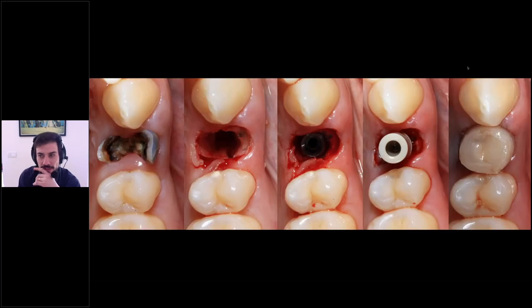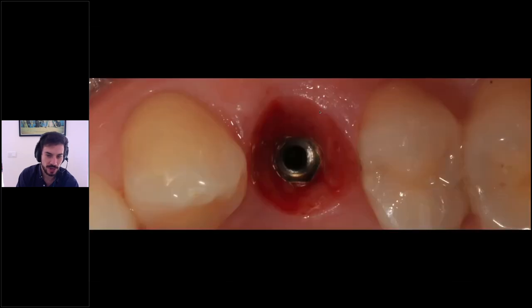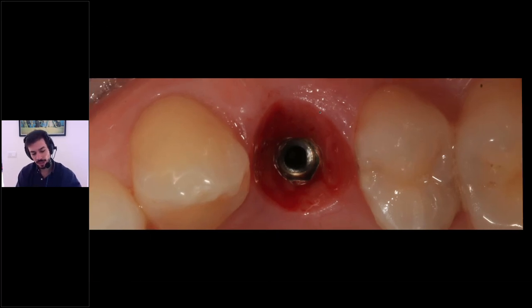If we have enough stability of our implants, we can go for immediate provisional restoration. I would love to use these PEEK abutments from TRI. They are really easy to bond our provisional restorations on. And after 4 months, we are able to copy the emergence profile of our provisional and order the final restoration and have an emergence profile like this with only one surgery. It's really a cool technique.